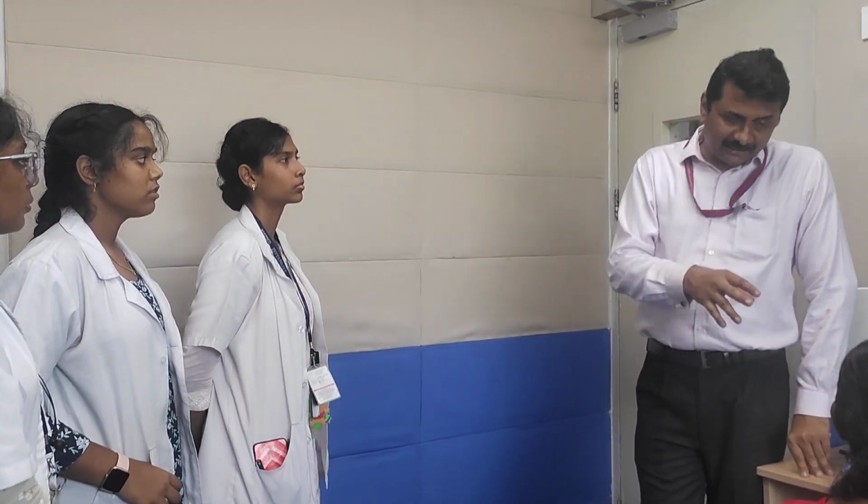There is going to be error. And the amount of error which is permitted in pure tone audiometer is how much? Let's say 250 Hz. I found out a threshold. The amount of error which is permitted is how much? Plus minus 10 dB, not more than that. If you do not take up your procedures appropriately, it's much likely that your findings are not okay. Nowadays we are having these digitally programmable hearing aids. It's much essential that the thresholds are okay. Don't take it casually. Okay?